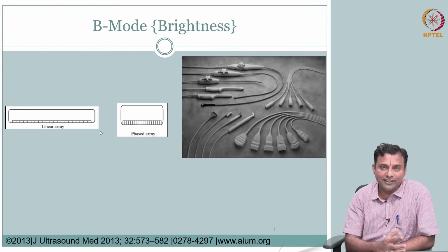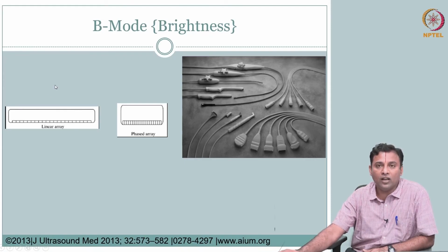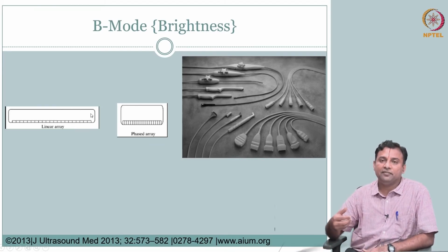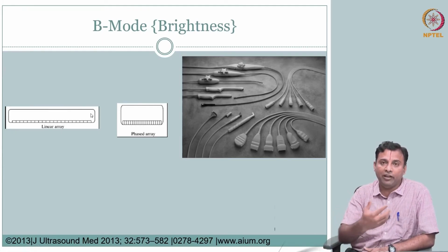What we covered in the physics, the mechanical beam focus, all the concepts of physics and the single element transducer are necessary. But most applications, except for some specialized ones, have moved to array and digital. So, the physics that we have understood so far, the wave equation, how do we execute it?